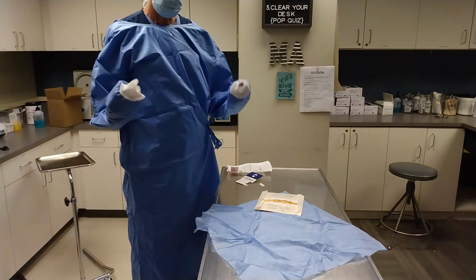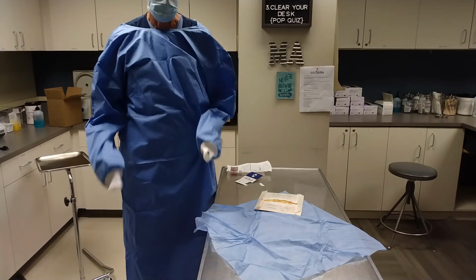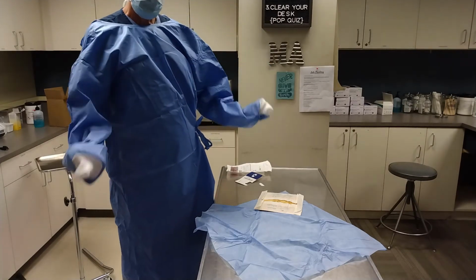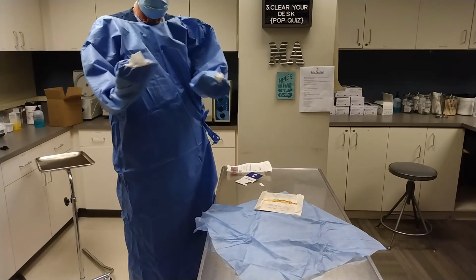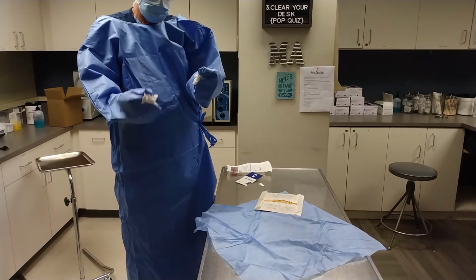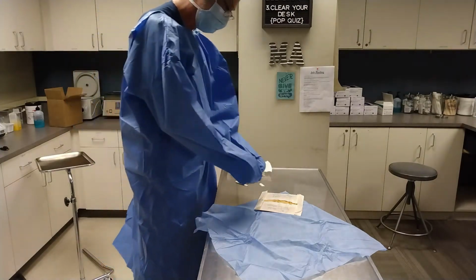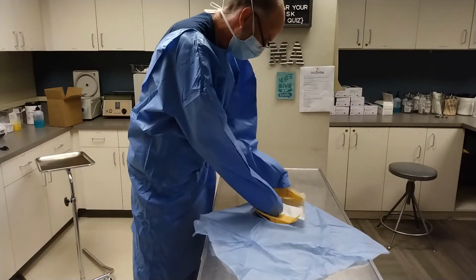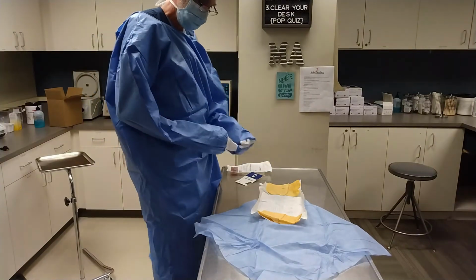So we already talked about how I'm scrubbed in, but my skin is still not sterile. This gown is on the outside, right? So I can touch things using these cuffs, as long as I keep my hands on the inside. So that's how I'm going to put my gloves on, right? Open the package. And I have right and left, okay?